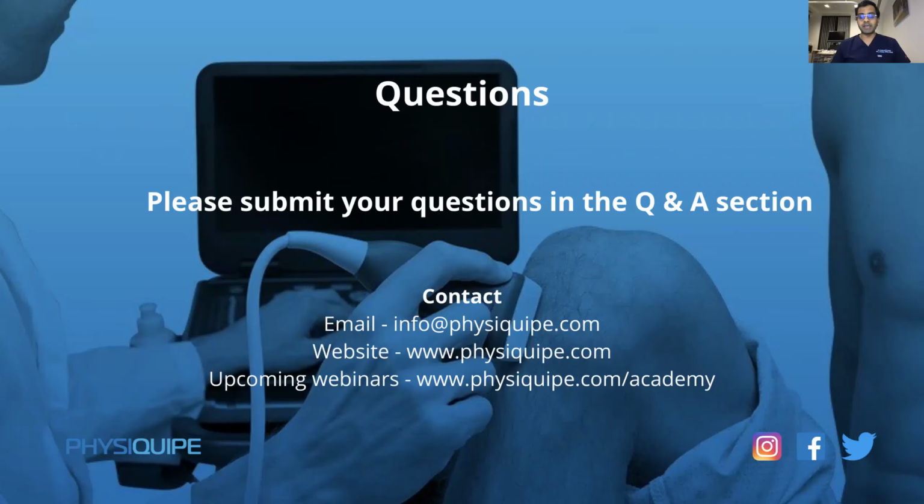So I suppose there may well be scope for dynamic imaging with MR kinematics. I know I've worked with some open scanners where, when it comes to the back, for example, or the spine, we can scan patients load bearing, stood up. You can see how some of the exit foramina in the spine or the lateral recesses can close down upon weight bearing. Similarly, with some of the other joints, you can potentially provoke certain movements and positions and scan patients in those areas to see whether that has any implication.